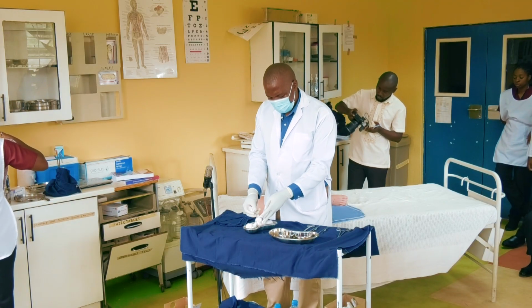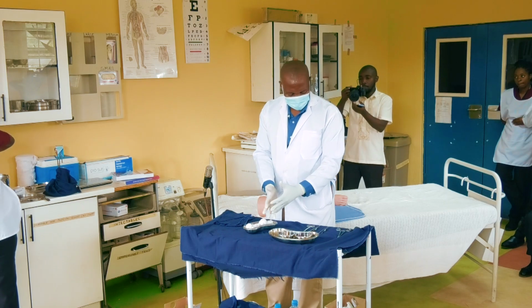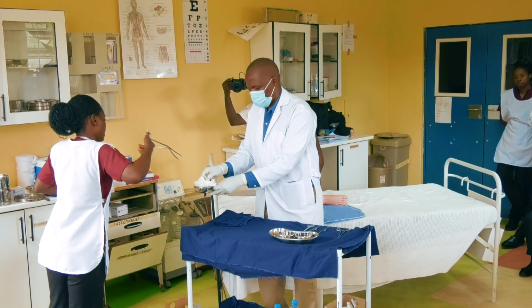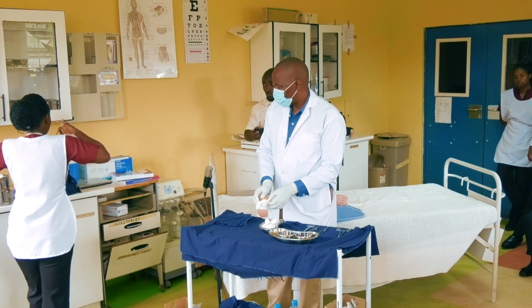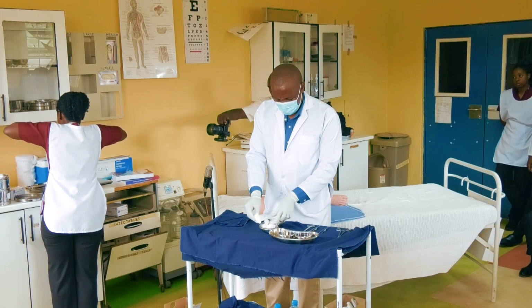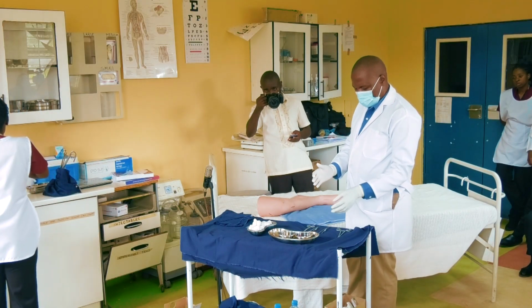If I'm gloved, I'm free to touch this thing. If you are not, sometimes when dressing, I'm sure you've been taught the types, sometimes you may need to. Okay, thank you. So I'm still watching her. Even when putting back, you lift that one, you put them back together. Okay, so I have what I need here.